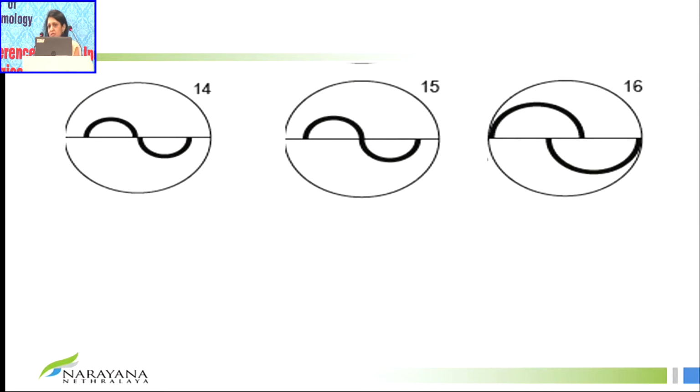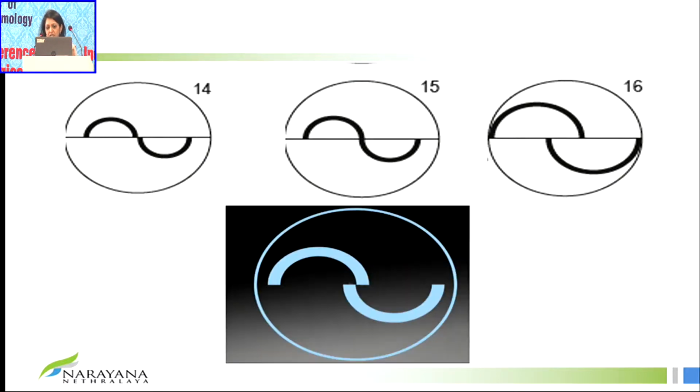So here you're seeing 3 pictures. Is any of these correct? Which one of these is right? None. So in the first 2, you need to increase the pressure. In the last one, you have gone beyond the pressure reading. So this is the perfect point of applanation.